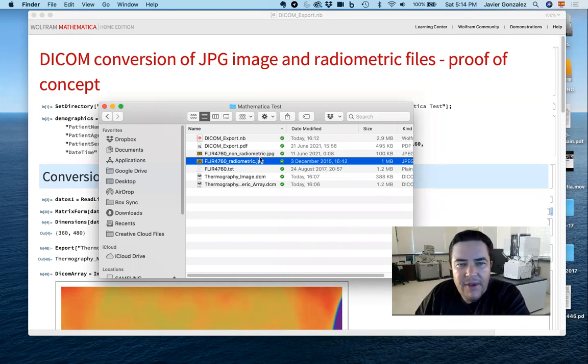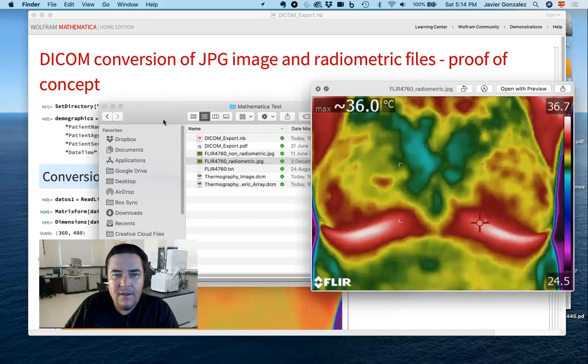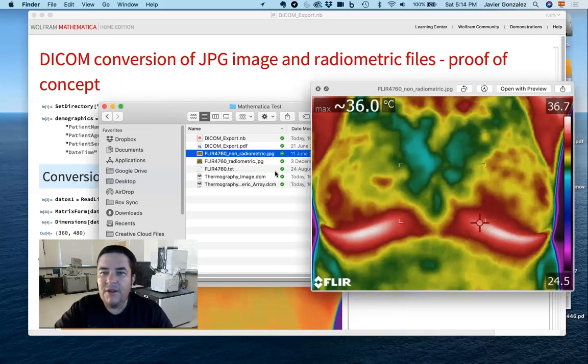So I also have here a non-radiometric 4760 file, which is also a JPEG file, but it's only 100K. That doesn't have the radiometric information. So how did I get that non-radiometric file? Well, I used the software development kit from FLIR for MATLAB, and I split the radiometric file into the JPEG file and the temperature matrix. So this is the radiometric file. This is the non-radiometric file.